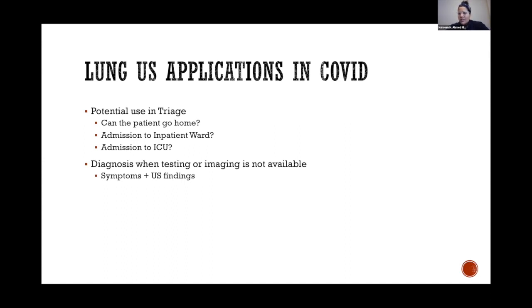One of the first things that we've thought about is where exactly is lung ultrasound useful in COVID-19 patients? There are several different places where we're seeing COVID patients. If we start at the ER, the question is, can we use this for potential triage? Can I take a patient who comes in and understand whether this is somebody that can go home, whether I need to send them to the ward or send them to the ICU, right? That's a very important point of contention right now because it's not entirely clear.